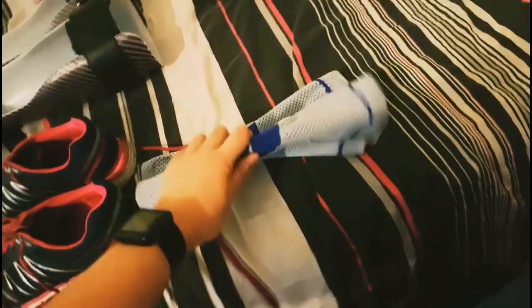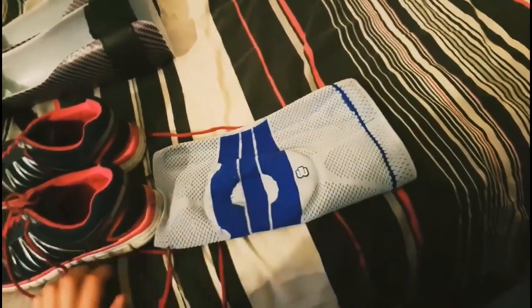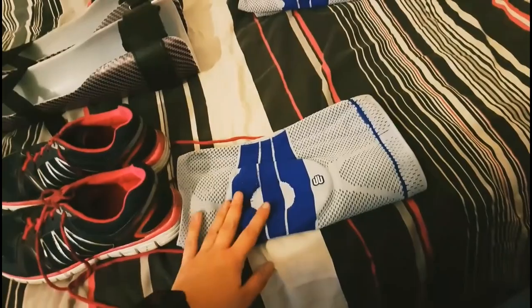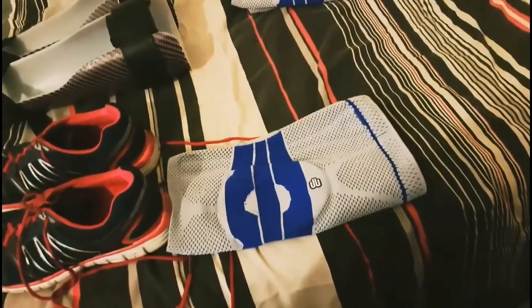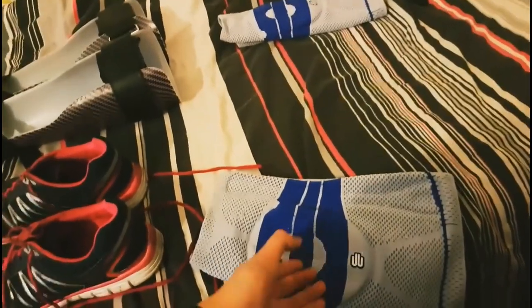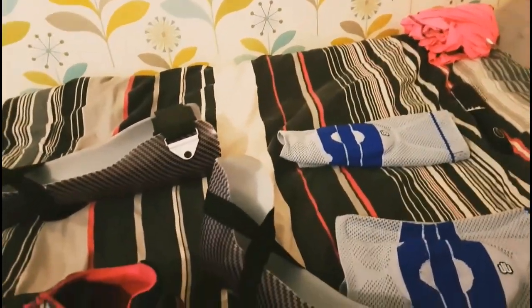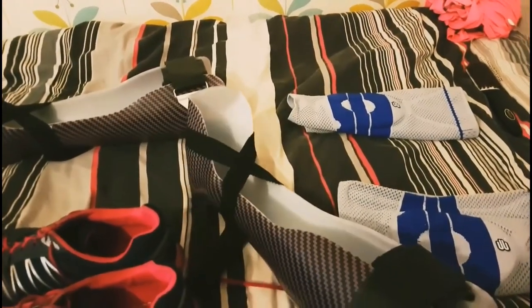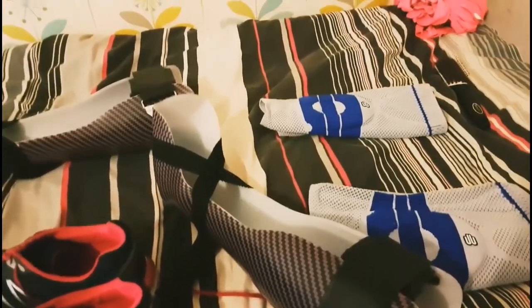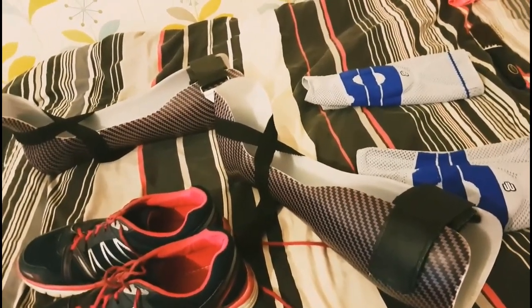But anyway, these are elasticated and they have hinges in them, which you can see running down the side of it there. And then there's a sort of donut shape buttress in the middle to keep my knee from dislocating. And this helps to stop my knee from bending backwards. And it keeps my patellas in place. And I have them for both legs, as you can see. And now these are real pig's ears to wear. I hate wearing these because they pinch you when you move and they cause pressure sores, which is why I'm only allowed to wear them for 1 hour maximum every day.